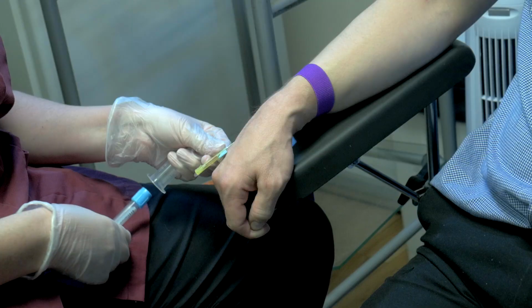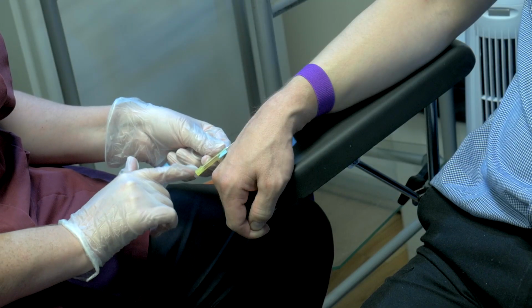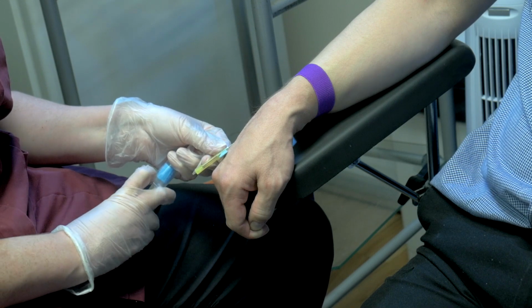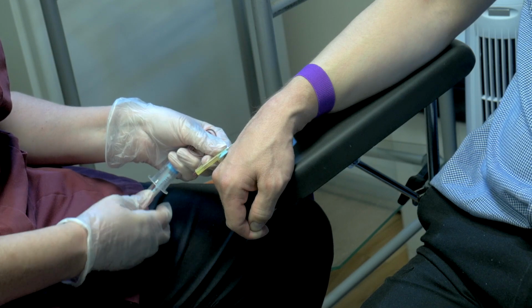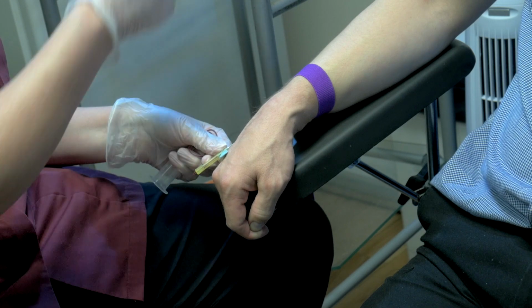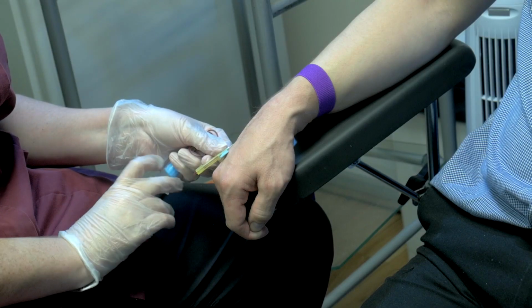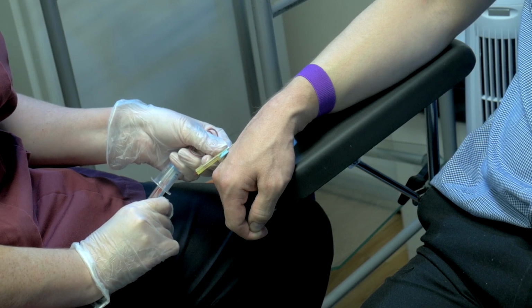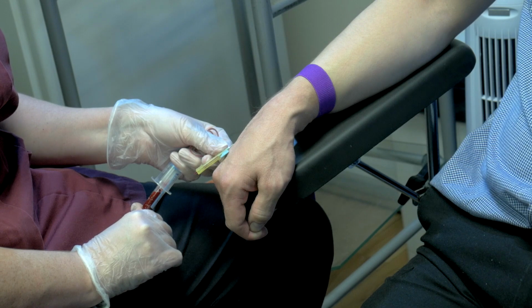So the first tube that I use, I'm going to pop it in. And because there's air in this tube here, we need to discard the first tube. So once that tube is full of air and we see blood in here, we can get rid of that. Then we get our first tube that we actually want to take blood with and pop that in. And we just wait for it to fill.